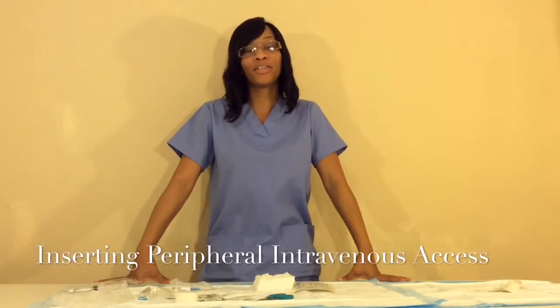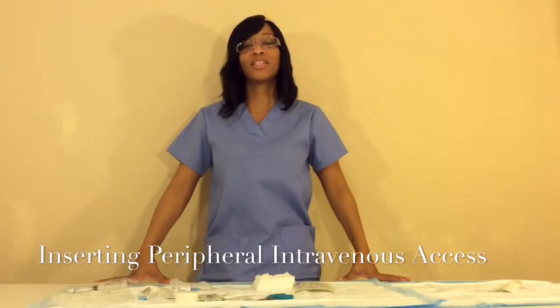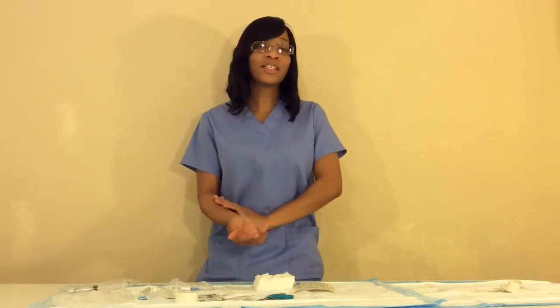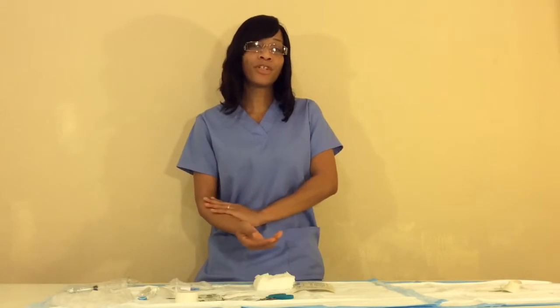Hello, I'm Kimberly McDonald and I'll be discussing procedures on how to perform a peripheral intravenous catheter insertion. First, you want to make sure the patient has a good understanding of the procedure. Then you want to assess the patient's arm — whether they're right-handed or left-handed — to ensure comfort and mobility.